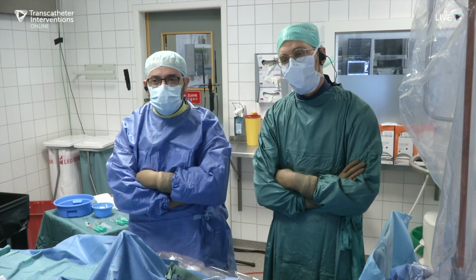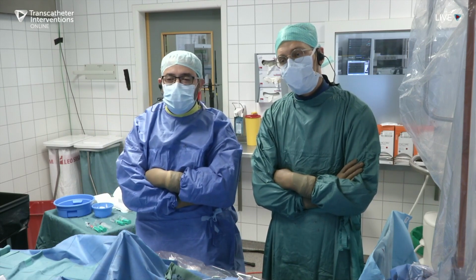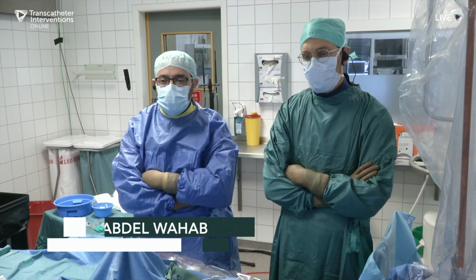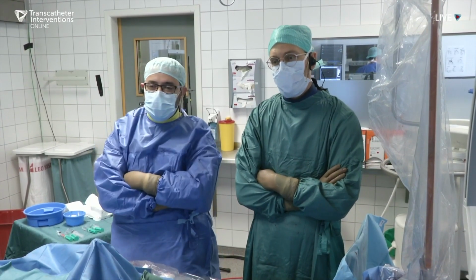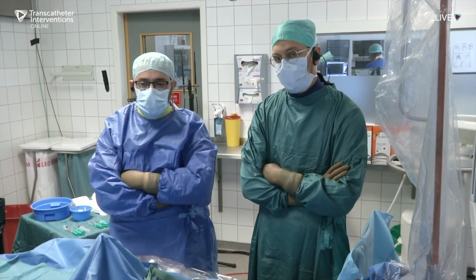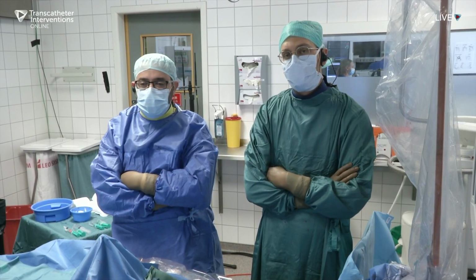So, good afternoon, everyone. I hope you can hear us from Leipzig. So welcome again to the Leipzig Heart Center. We're today in the cath lab. My name is Mohammed Abdel Wahab. On my left-hand side is Nico Mayunke, who's going to do the case. We have Ulrike and Ines helping us from the cath lab team.